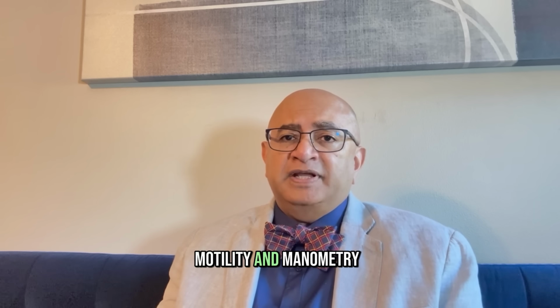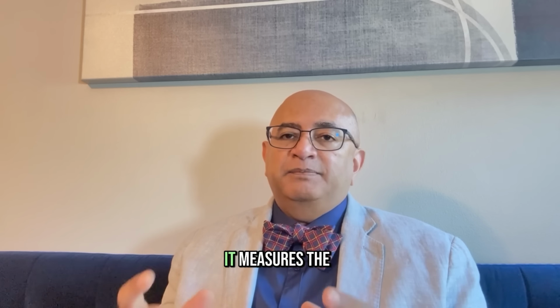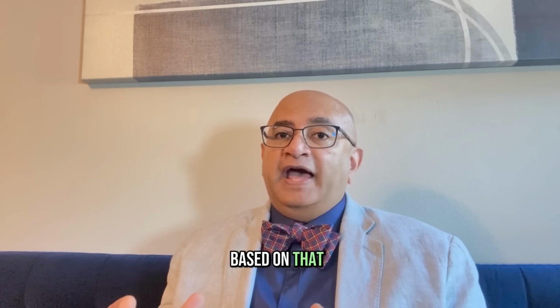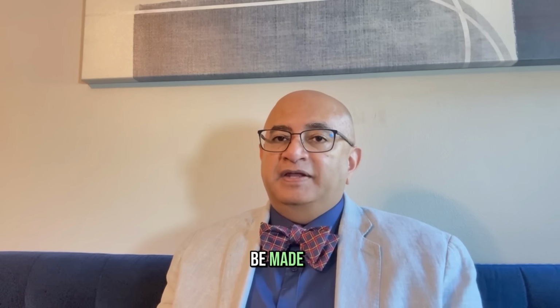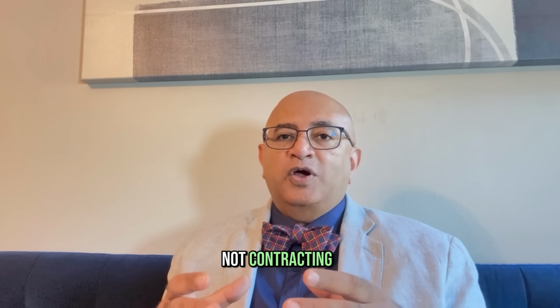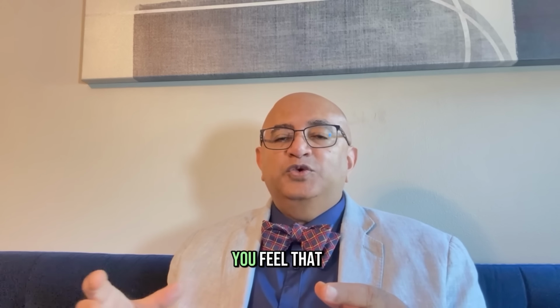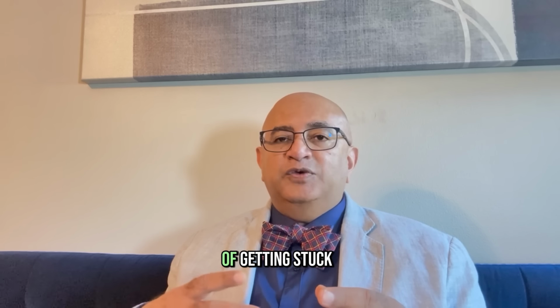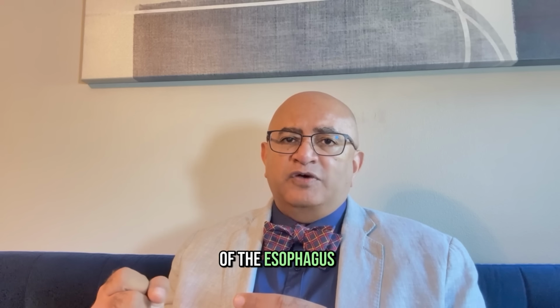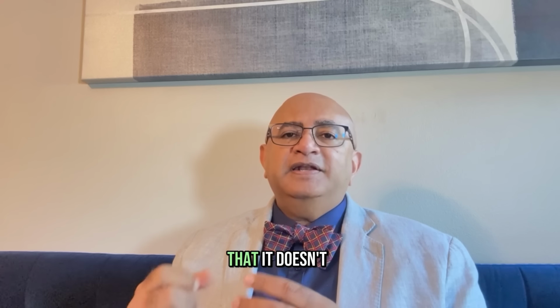So what is motility and manometry? It measures the contractions, it measures the pressures inside your esophagus. Based on that, several diagnoses can be made. It is possible that your esophagus is so relaxed that it is not contracting, not having regular peristalsis, and that is the reason why you feel that slowness or the feeling of getting stuck. Or you have such intense spasms of the esophagus that it contracts so strongly that it doesn't open up.